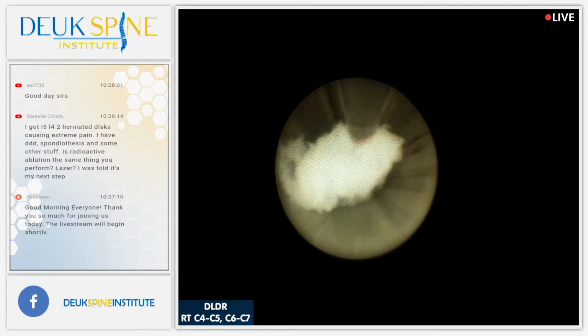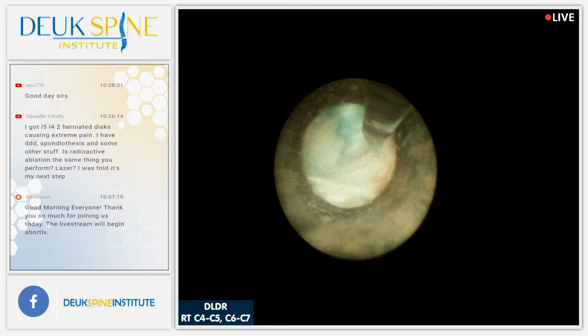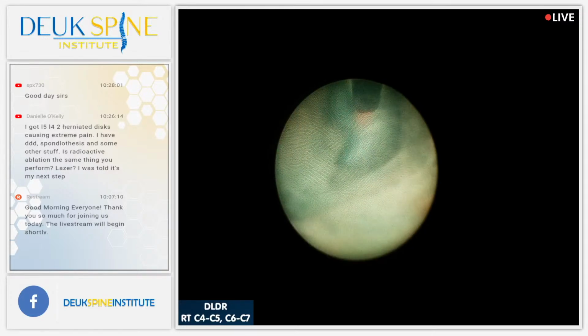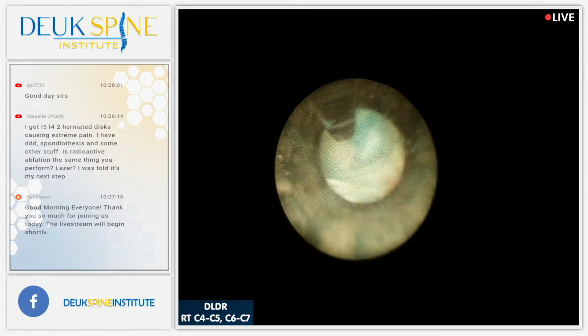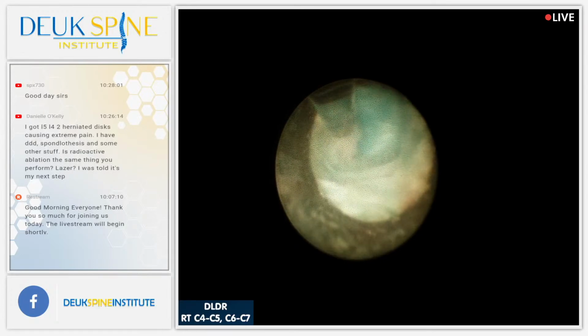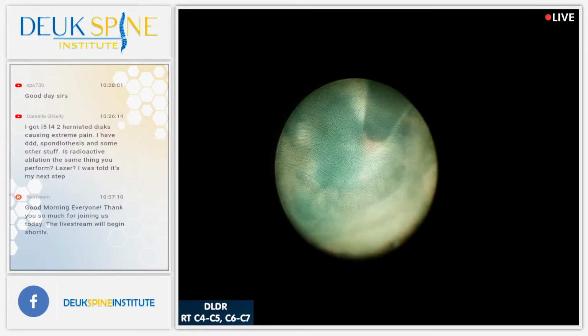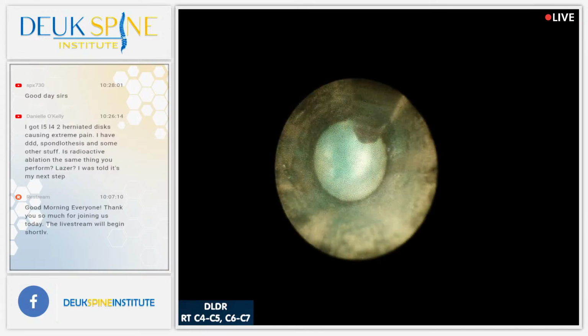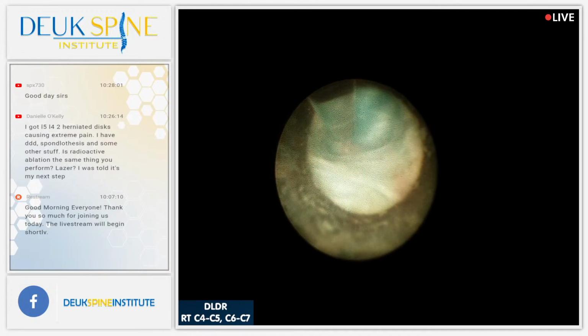Oh yeah, there it is, big one. So do you see that piece of herniation? That happened with one event. There's the spinal cord, folks, right there. That is the spinal cord. It's stained a little bit blue because the dye went through the tear like I showed you earlier. Okay? That's the spinal cord right there. And there's a huge defect in the PLL where the herniation was.